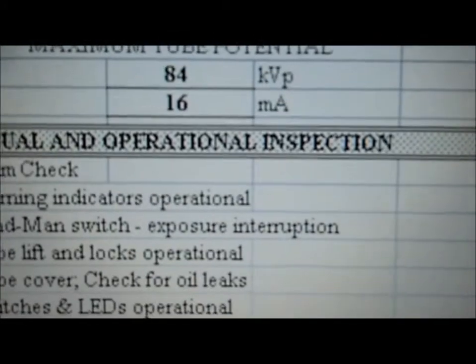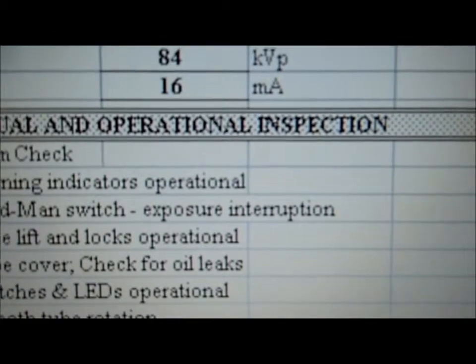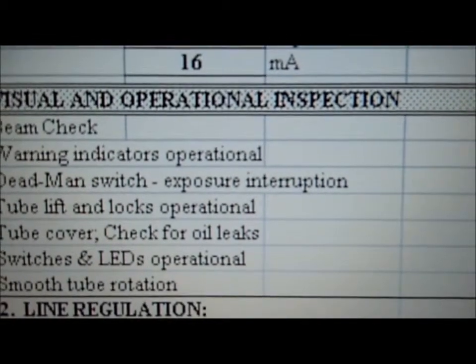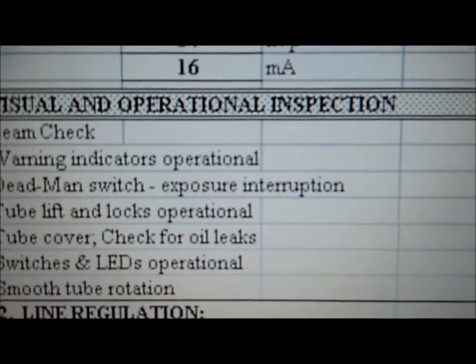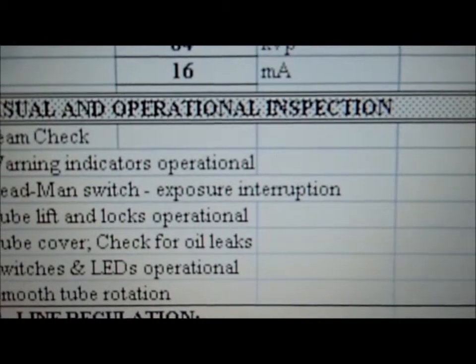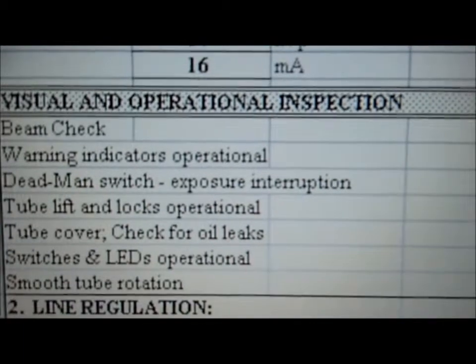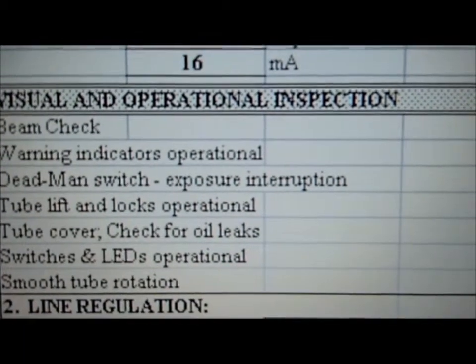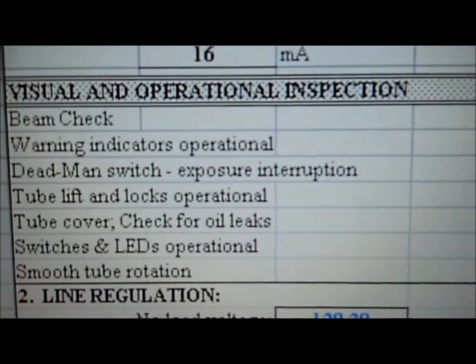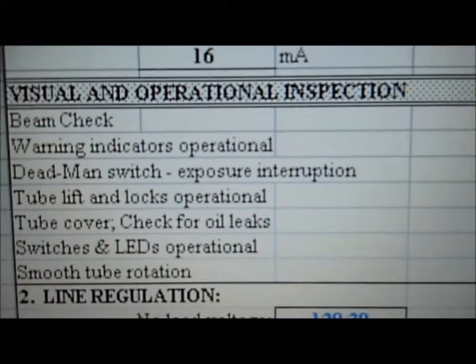Moving along, here are some visual and operational inspections or checks that we will perform. First is the beam check. Here we will go into the software and actually take a shot and measure the contrast and densities of the beam. Next is the warning indicators, the dead man switch or exposure termination. Here we'll press the button, and halfway through the scan we'll release the button, and it should alarm premature exposure.